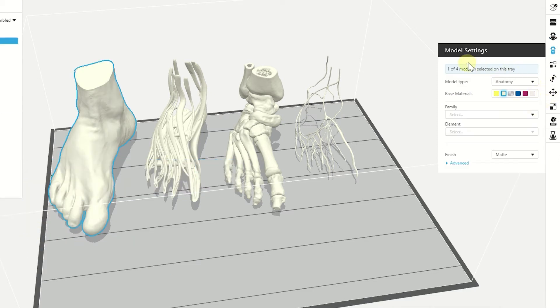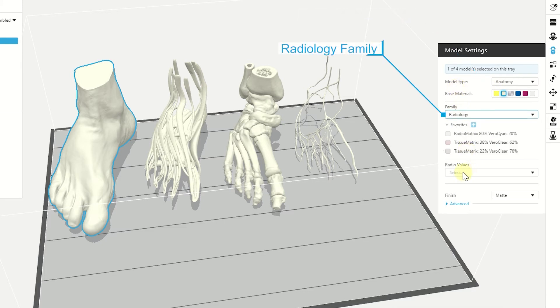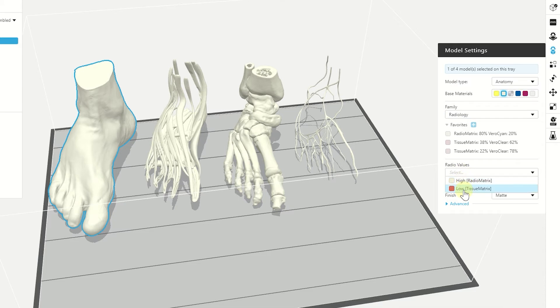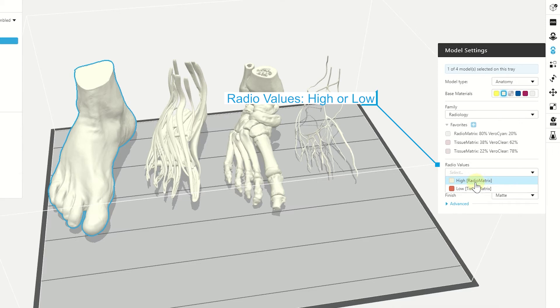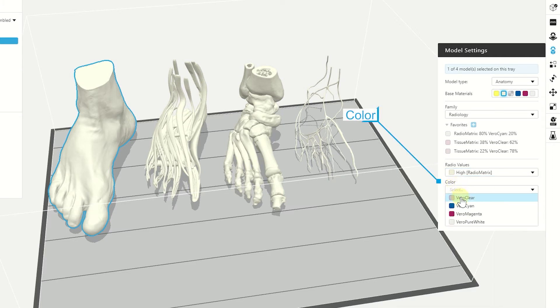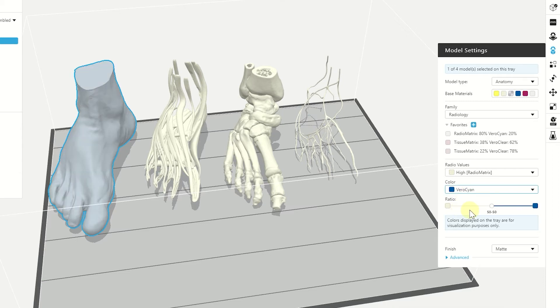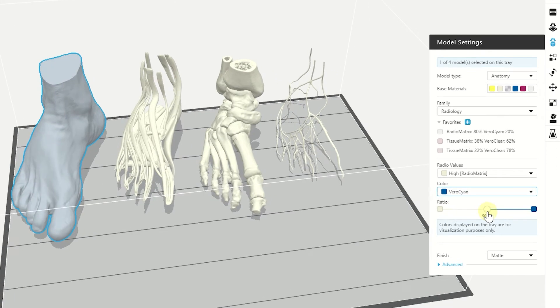So we will go to the model settings and choose anatomy model type. The family will be Radiology and we have two different radio values. We have high which is mixture of radiomatrix and low which is mixture of tissue matrix. Then we need to pick a color. That's the material that we want to mix with the radiomatrix. So it can be either one of the Vero family or bone matrix. So let's just choose Vero cyan.